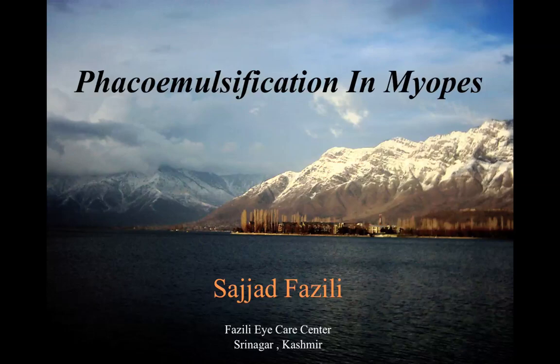I'm Sajjad Fazli. I'm discussing with you a few tips in phacoemulsification in myopes. We know that cataract surgery is arguably the most powerful refractive surgery because the new lens implant can correct just about any degree of myopia, astigmatism, and even presbyopia at the time of surgery.